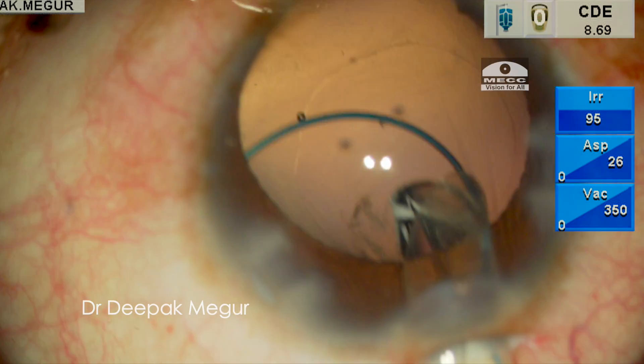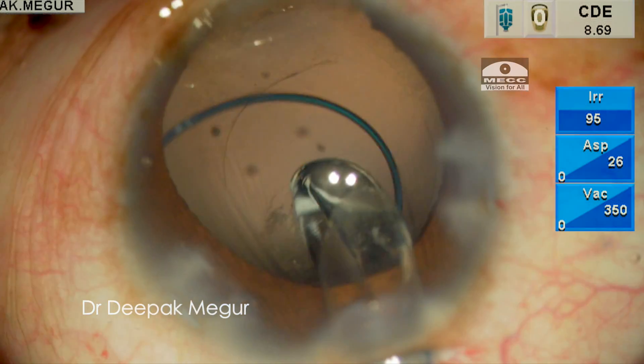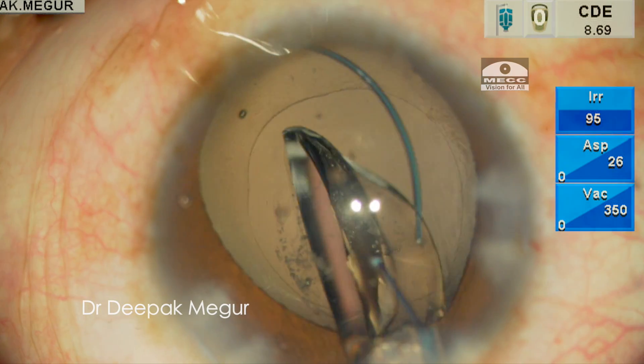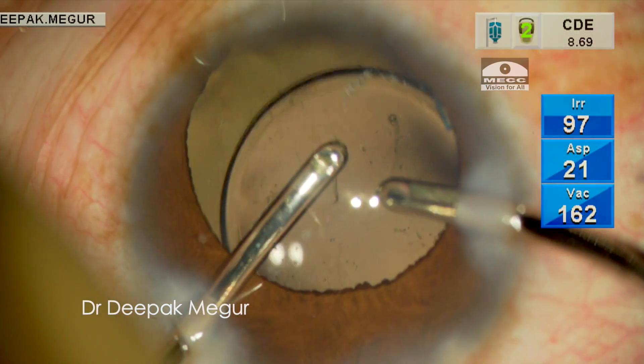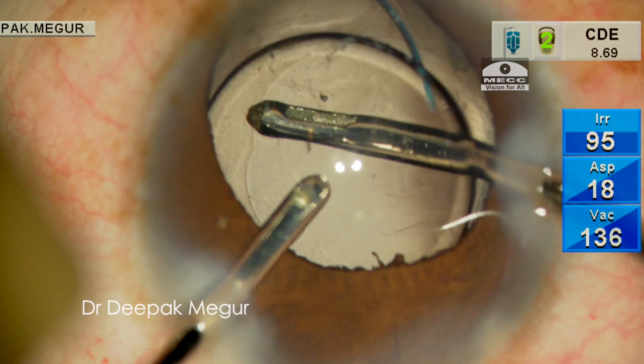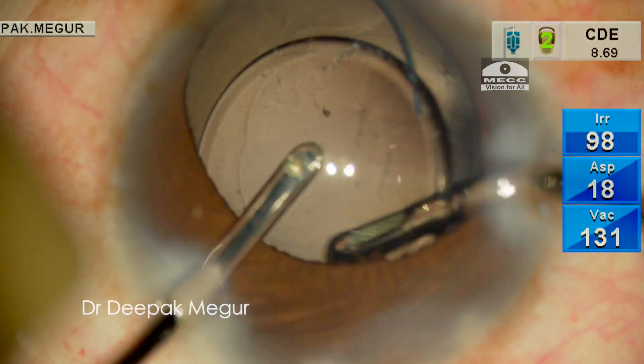Finally, a multi-piece hydrophobic intraocular lens is placed in the bag. The OVD both in front and behind the lens is gently aspirated, and that's it — the case is done.